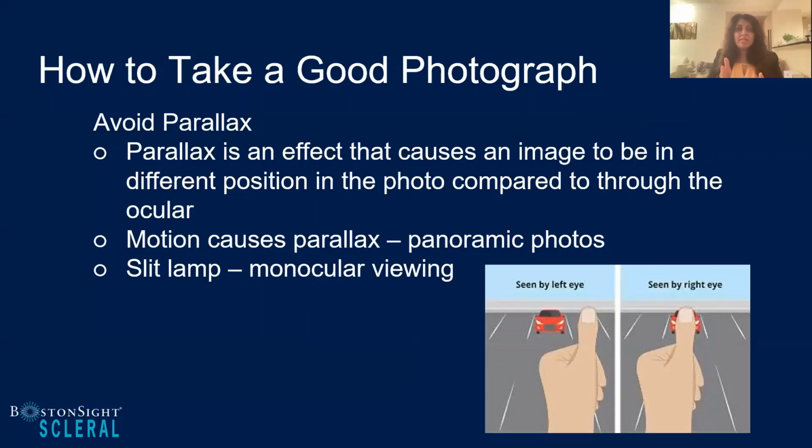When you're looking at an image through with your dominant eye, you've got that image, you cover the dominant eye, and then that image can shift, kind of like what this image is showing you down here, where the non-leading eye is not focused on the exact same thing. Something similar like that can happen in a photograph.